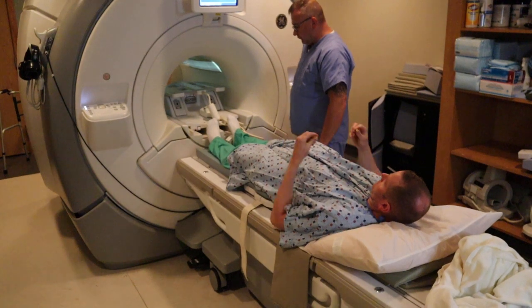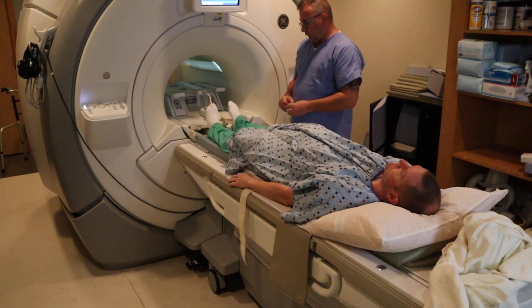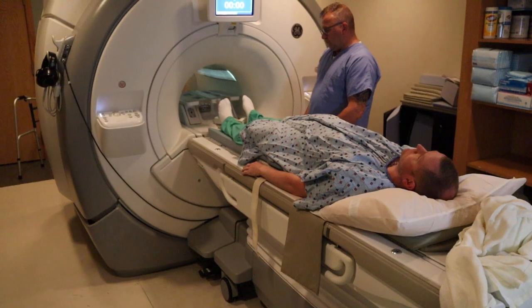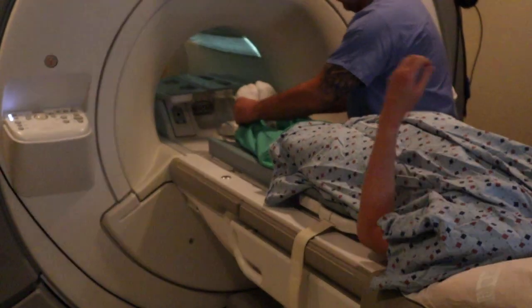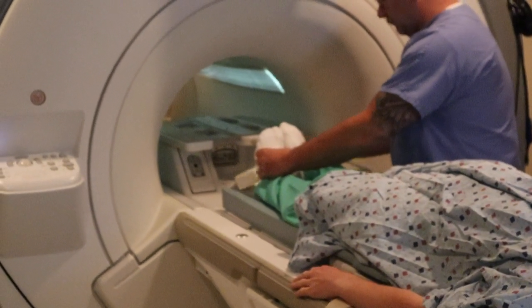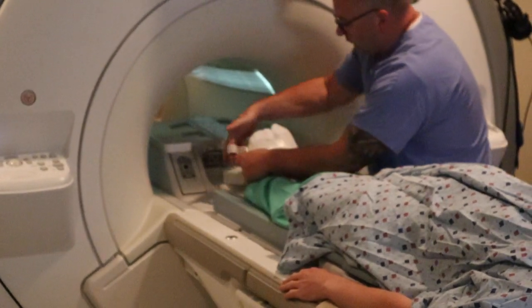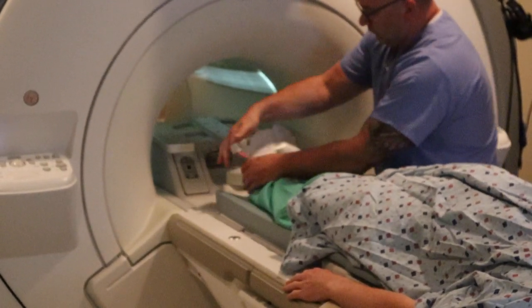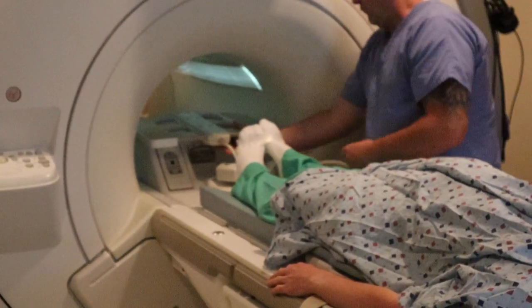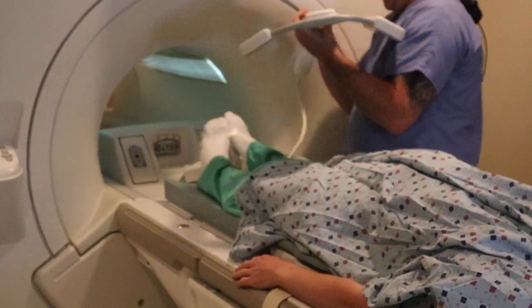The coil has an anterior and posterior piece. With a hip study, make sure there is no pillow underneath the knees. You want to make sure that the feet are in anatomical position — here you can see the technologist straightening out the feet to best place the hips in anatomical position. Tape the feet with either a band or tape to ensure they stay in that position for the entirety of the scan.